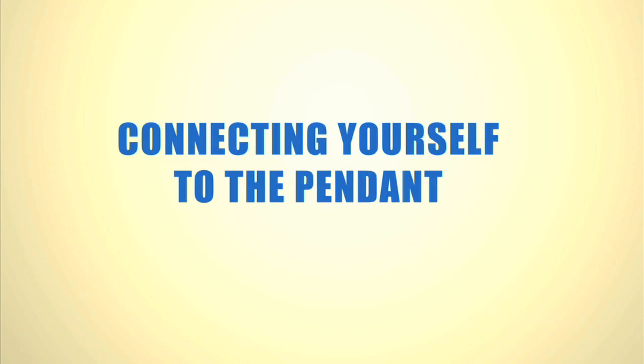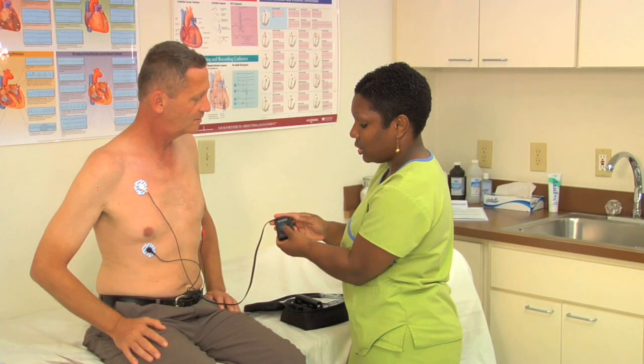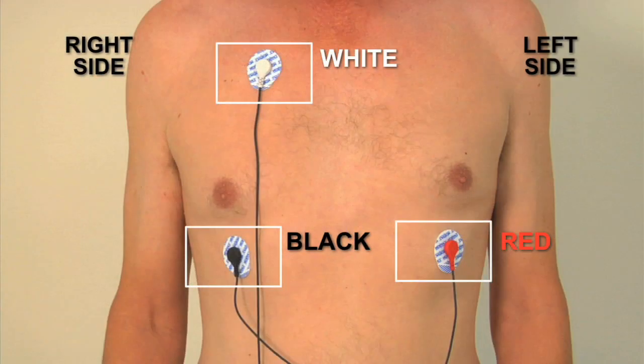Connecting yourself to the pendant. Your doctor's office may have connected you to the monitor, but let's take a moment to review the process on how to connect yourself. The center of the patch should be within the areas indicated by the boxes. The number of electrodes you are wearing may vary from those shown, but in most cases you'll be wearing three electrodes. Before applying the electrode patches, follow steps one through three on how to prepare your skin. The type of electrodes you are using may vary from those shown, but the functionality is the same.